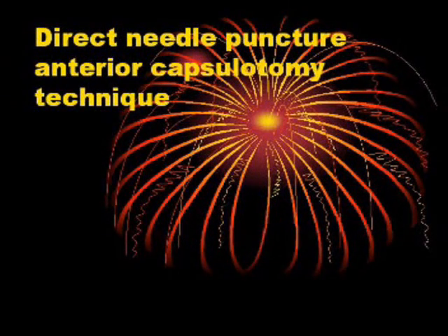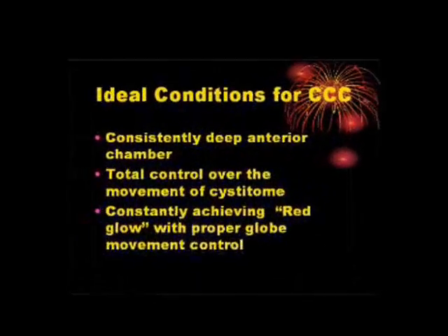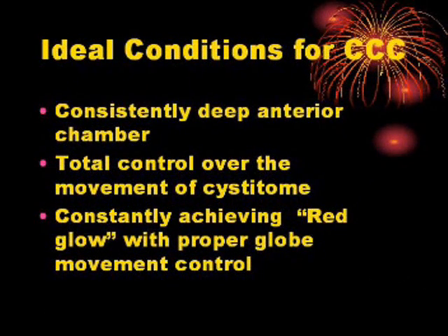Direct Needle Puncture Anterior Capsulotomy Technique. Ideal conditions for CCC include a consistently deep anterior chamber and total control over the movement of the cystitome, constantly achieving a red glow with proper globe movement control.